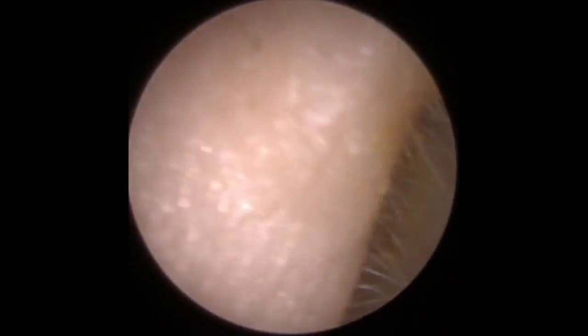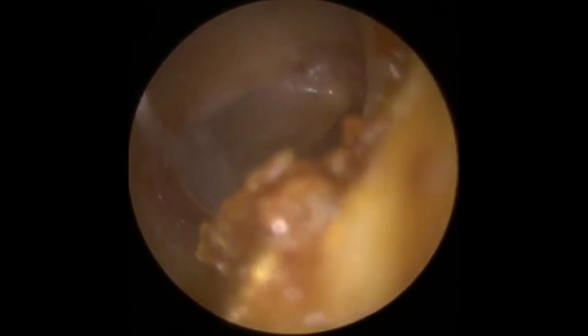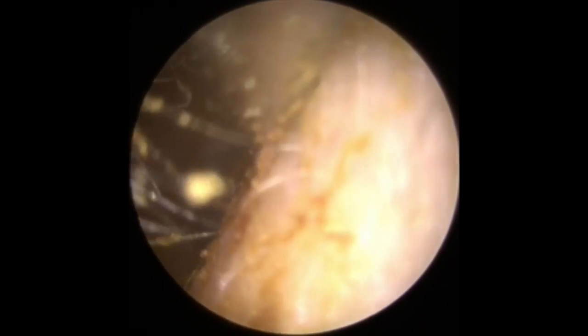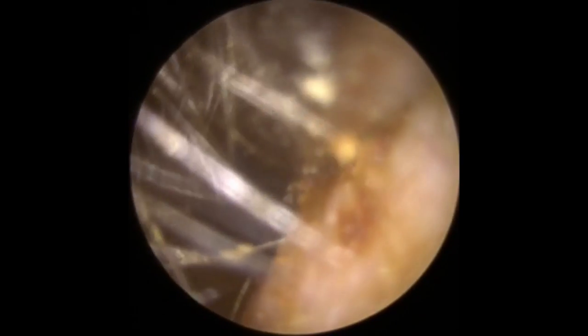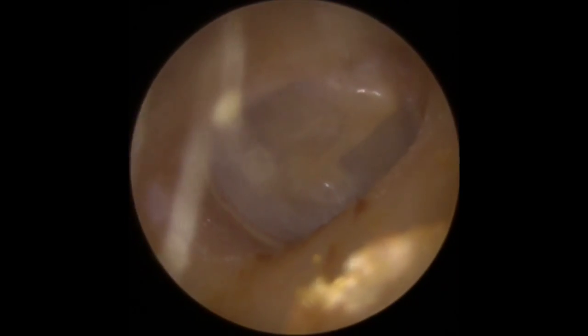So we've got it out rather than putting that down and getting another tool. You can see the eardrum there. There's a little bit of wax to the right side here, so we're just going to hoover the top end of that off just to get rid of it. And there's the eardrum.